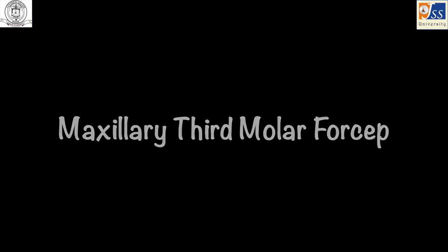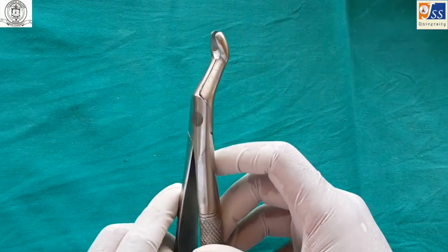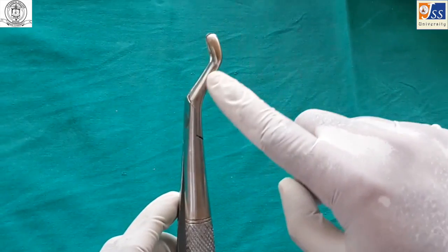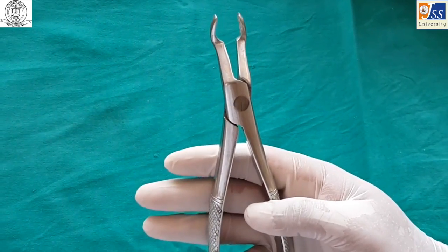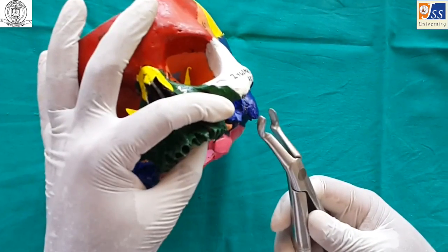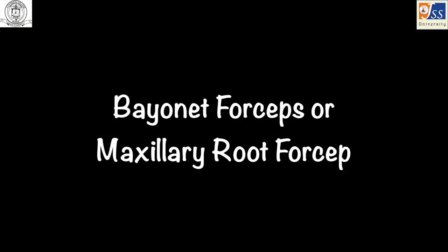Maxillary third molar forceps is designed keeping in mind that maxillary third molars often have fused and bulbous roots. The beaks are rounded, and the handle is sharply bent to facilitate better reach.